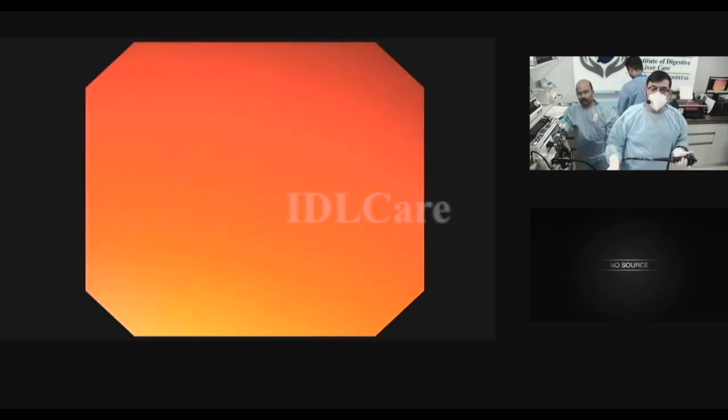So all this evaluation that I did was from the proximal 5 centimeters beyond the GE junction. Now we will go to the duodenum.